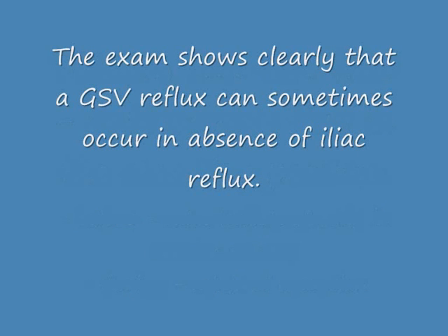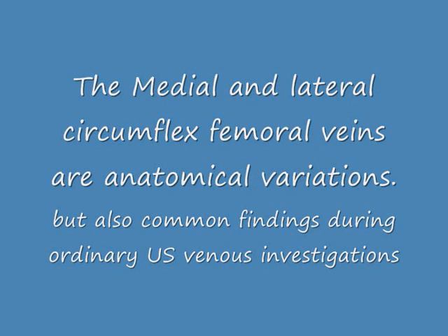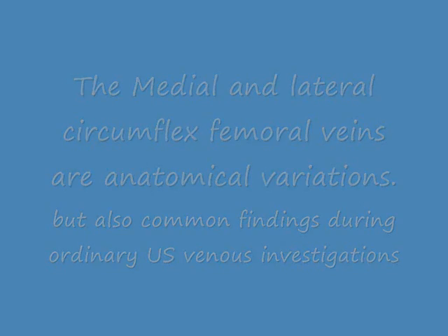The exam shows clearly that a GSV reflux can sometimes occur in absence of iliac reflux. The circumflex femoral veins, medial and lateral, are anatomical variations, but also common findings during ordinary EchoDoppler investigations of the venous system of the lower limbs.